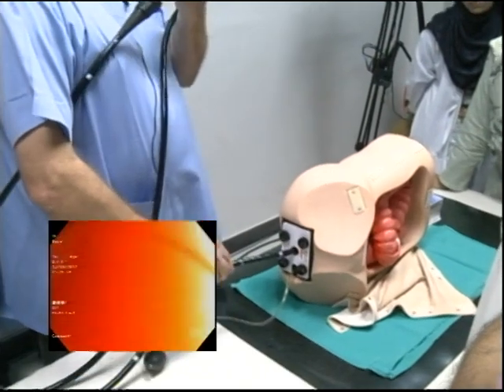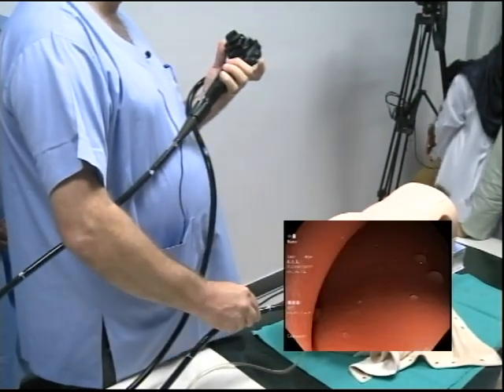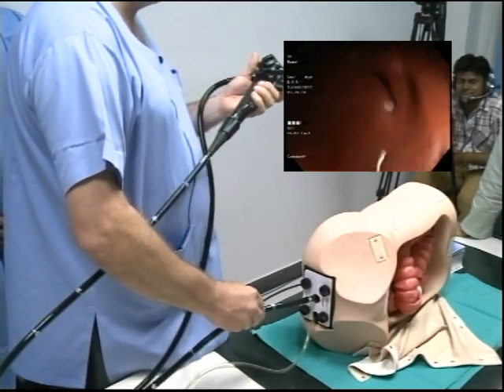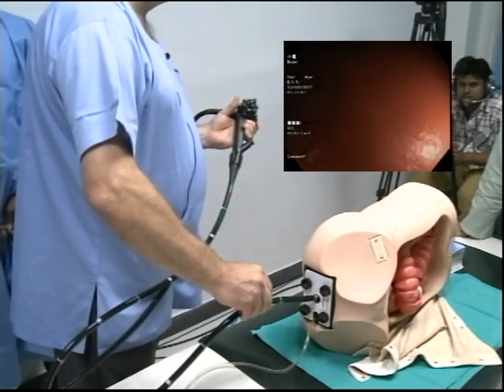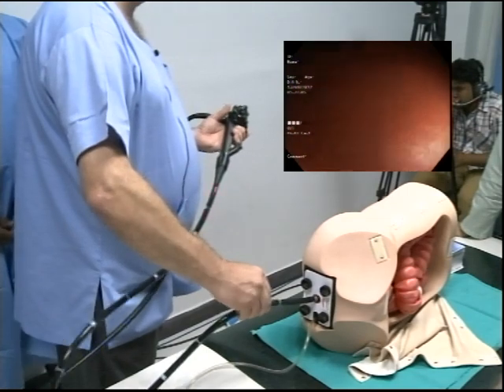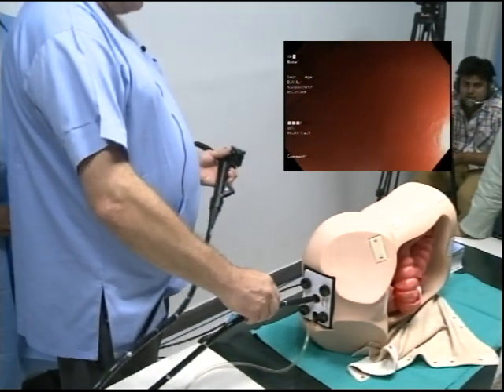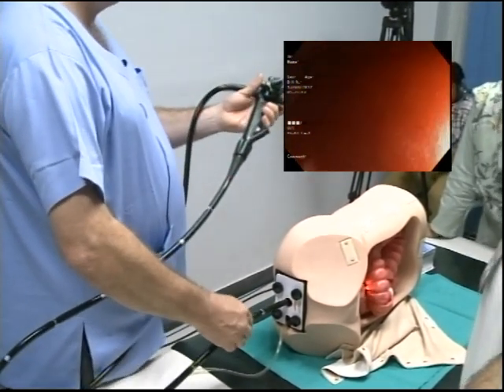Bring your hand up, so now the scope has gone clockwise torque. Yeah? See that fold? Remember the fingers? I need to go further away from it, and then anti-clockwise to move the fold. See the fold? It's still not gone away. And then anti-clockwise to move it away. Again? Down, anti, up, clockwise. Doesn't matter which. What I'm saying to you is anti-clockwise. So far, I've not touched the little wheel.